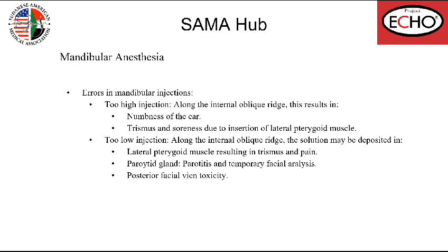Errors in mandibular injection: too high injection along the internal oblique ridge. This results in numbness of the ear, trismus and soreness due to insertion through the lateral pterygoid muscle. Too low injection along the internal oblique ridge: the solution may be deposited in the lateral pterygoid muscle, resulting in trismus.